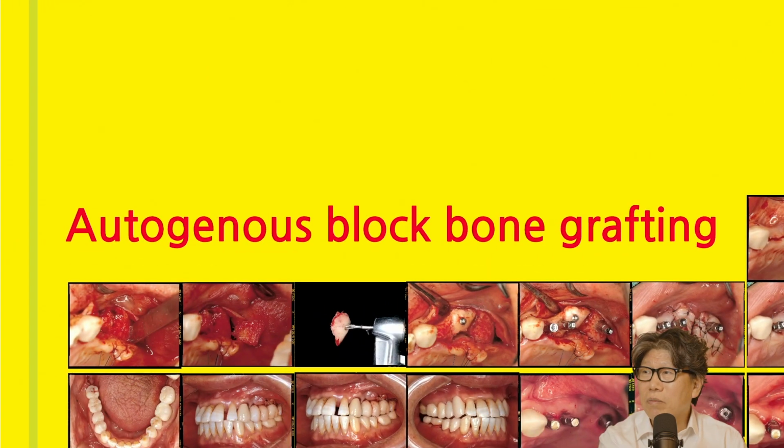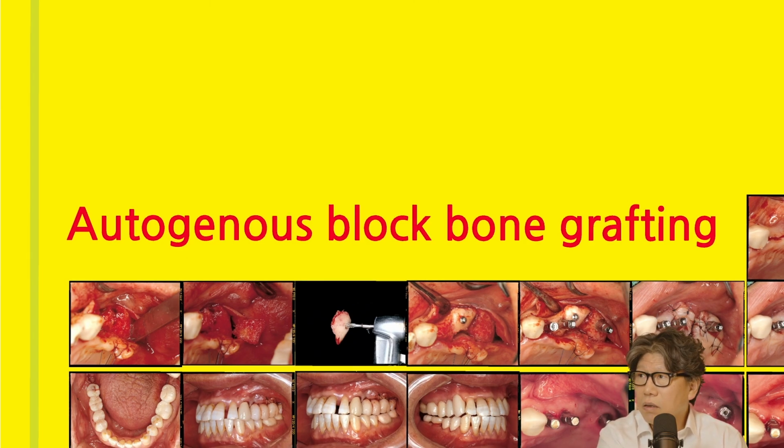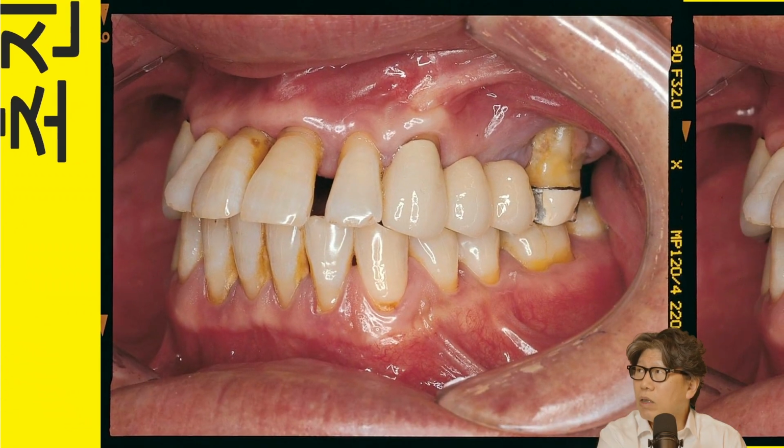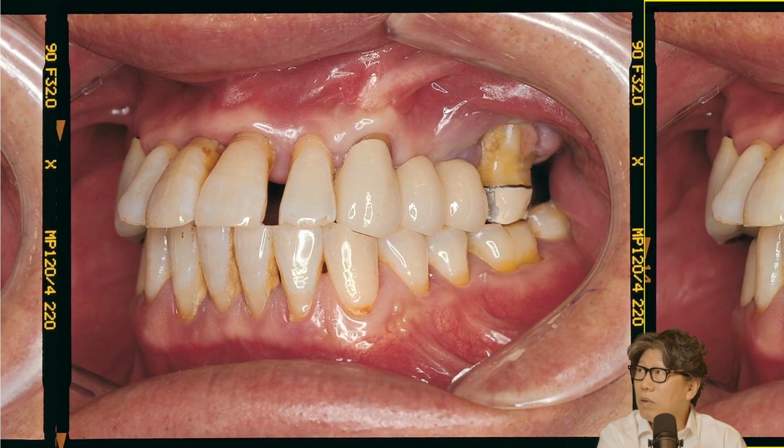And then I used to use block bone a lot, personally. Carl Misch used to like block bone, and I used to like block bone a lot. But then I realized that the implant is more important, regardless of whether or not you use bone. I still follow up with this patient. He's been with me for almost 25 years now, and I've been following up with him for a long time. So here we are. There's no bone.